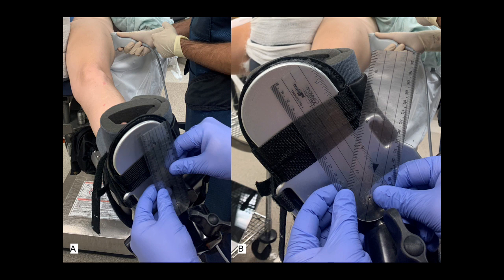extended. The ultrasound is placed perpendicular to the skin, and the ultrasound transducer is placed in the transverse oblique plane parallel to the axis of the femoral neck. This transducer position creates an image similar to the transverse oblique plane obtained by a magnetic resonance image. The image on the left shows the limb in neutral rotation, while the figure on the right shows the limb in internal rotation.